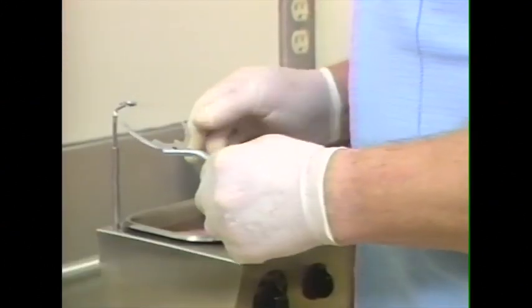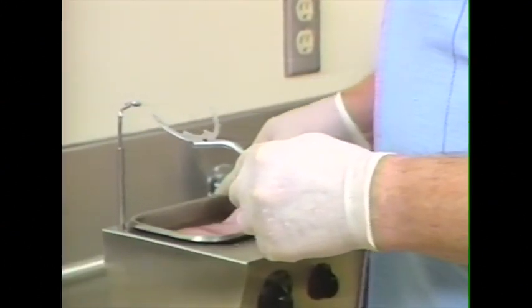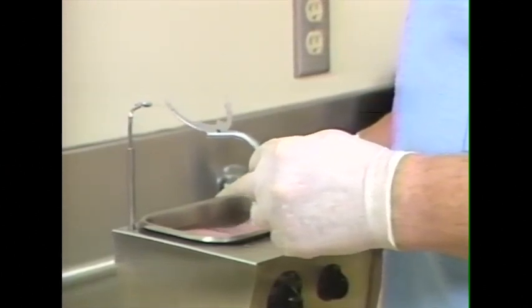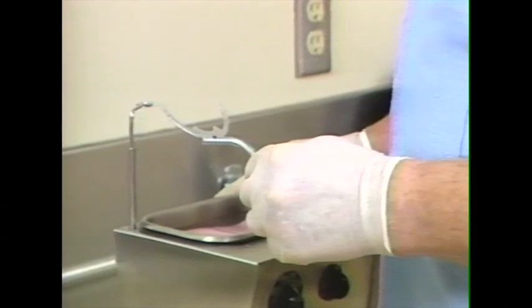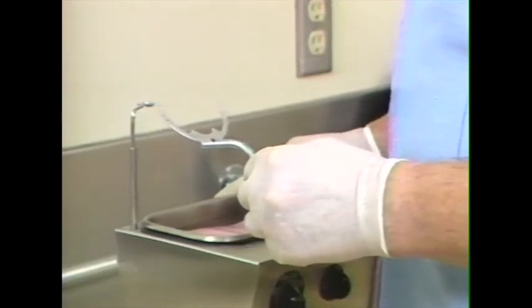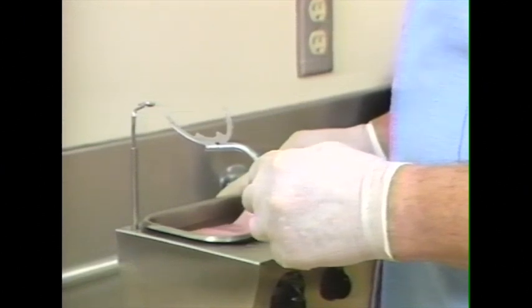Today, Mrs. Johnson, we're going to use this caliper device, which fits into your ears, to transfer the relationship of your upper jaw to a laboratory instrument. To prepare the bite fork for the Facebow transfer, we're going to use a sheet of baseplate wax as the recording medium. Compound can also be used for this purpose, but baseplate wax is a little more simple to use.